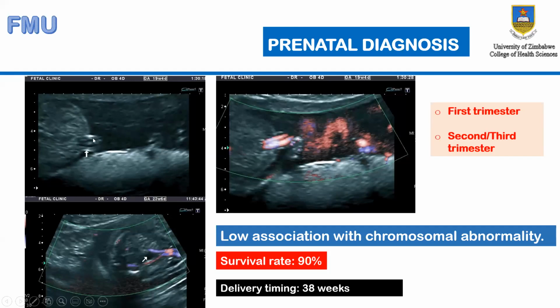But the 3 lines should be seen. These 3 lines represent the cord insertion, umbilical cord insertion here. As we are demonstrating with the color, here we are picking the 2 umbilical arteries. But remember, there are 3 vessels here, right? We have these 2 umbilical arteries, and we also have got the umbilical vein.